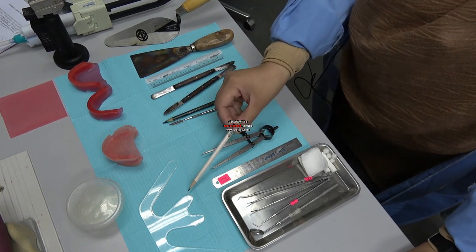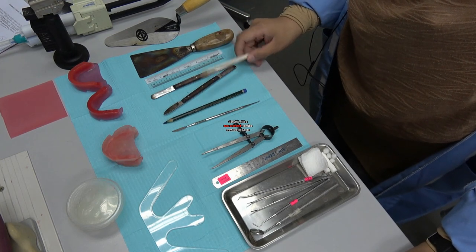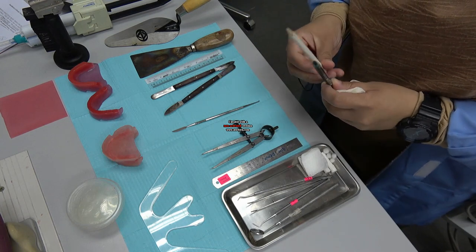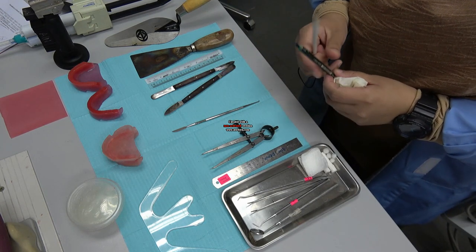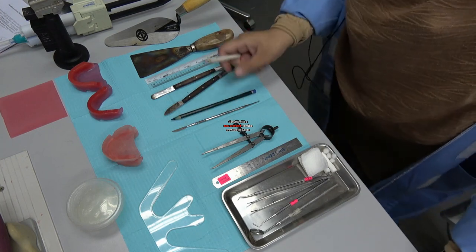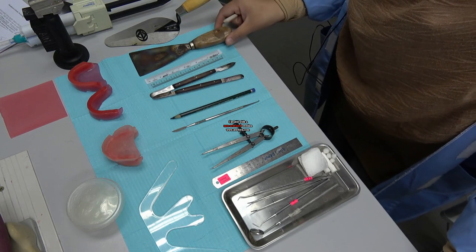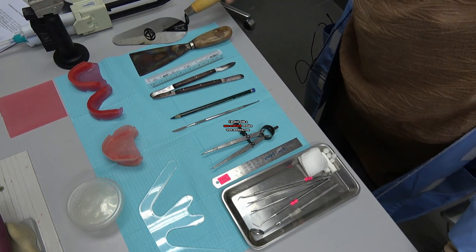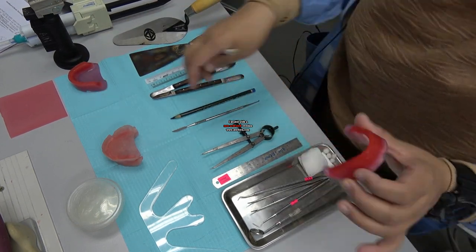Right, the Fox plane, Lacron, indelible pencil. Indelible pencil is a bit different from a normal pencil. You have to request it from the nursing station. Right, the wax knife, scraper, and your occlusion rim.